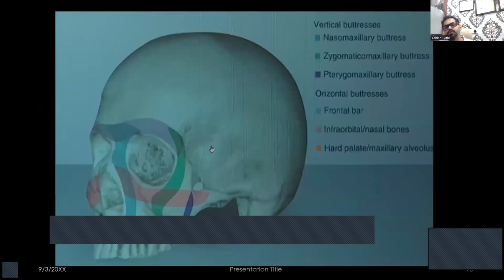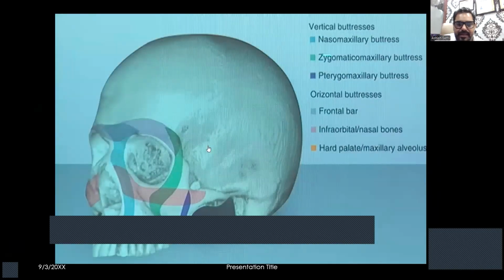So the question arises, why we choose these locations? Because maxilla is a distributing unit and mandible is absorbing unit. तो मैक्सिला के अंदर सारा फोर्सेस आकर के वो पूरे स्कल में डिस्ट्रीब्यूट होता है by these pillars. These pillars are नेजोमैक्सिलरी पिलर, जो मैंने आपको कैनाइन इमिनेंस का भी बताया था, ठीक है ना. This is जाइगोमेटिक पिलर and पोस्टीरियर टेरिगोइड पिलर. और हम लोग सारे के सारे बोन जो है टेरिगोइड पिलर्स पे, जाइगोमा पे या नेजल फ्लोर के थ्रू डाल रहे हैं. That is how we are transferring the force to the complete maxilla.